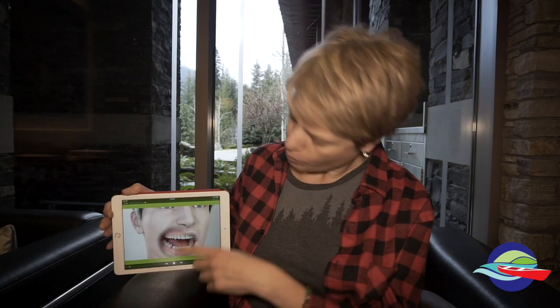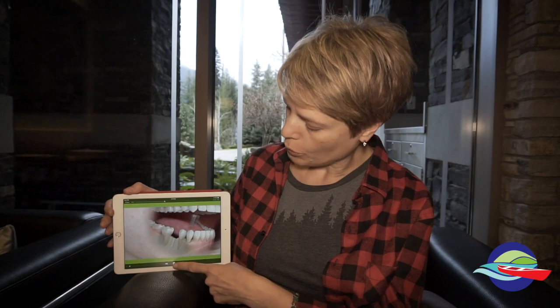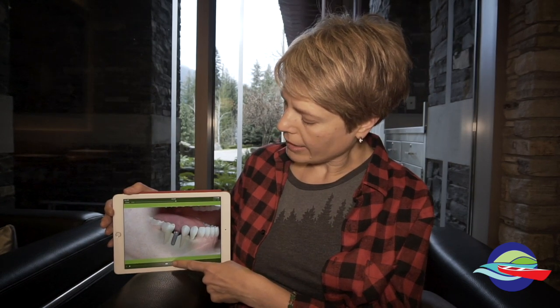And essentially what it does is it builds up a 3D volume, and it allows Dr. Fritz to do a virtual surgery before he even touches the patient, so the patient knows that we're doing this surgery, knowing exactly where we want to place it, and it will be a safe procedure. When we place the implant, it will go directly into the area where the natural tooth was. Of course, it's not going to look like a natural root, so I explained to the patient that the implants are different sizes, and they're placed according to the anatomy and the function we expect from that dental implant.